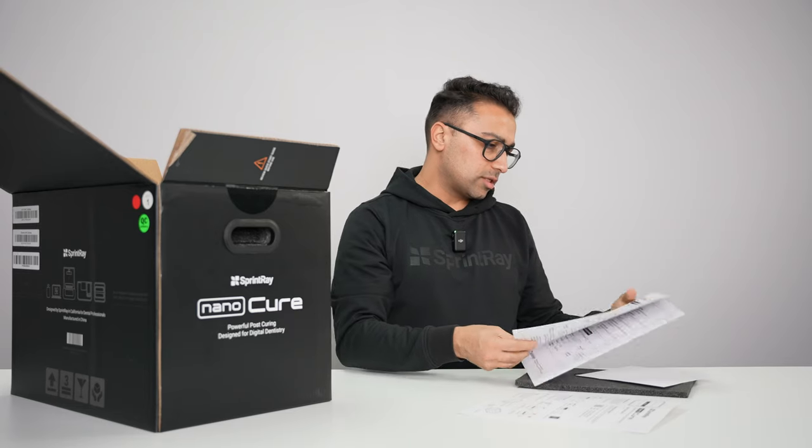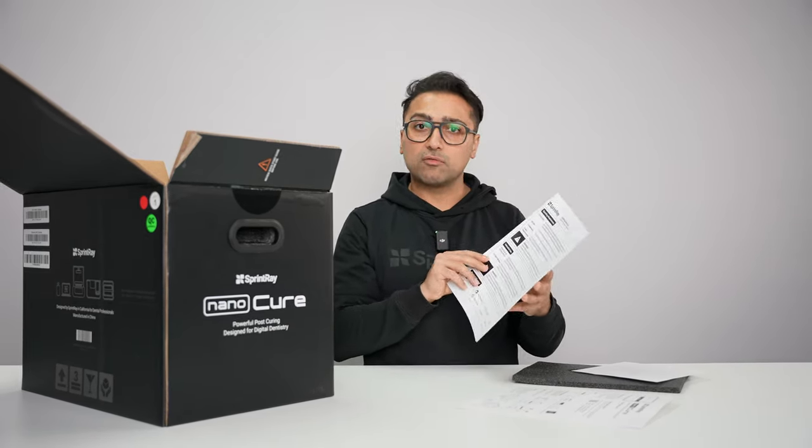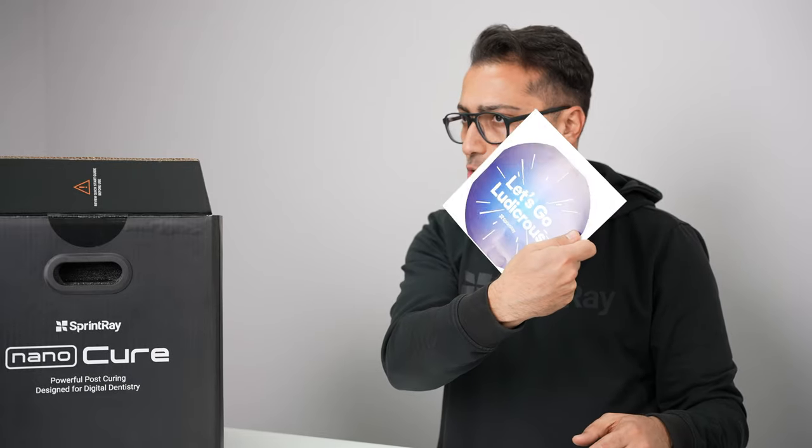We're gonna talk about it. There's a Supplemental Safety Sheet. This talks about just basic safety information while using NanoCure. You get one of these cool stickers.